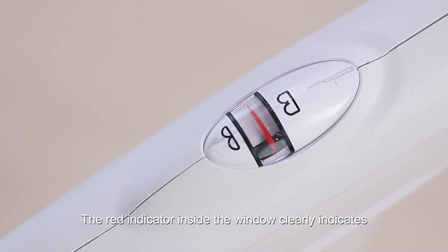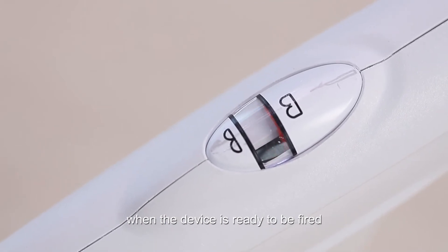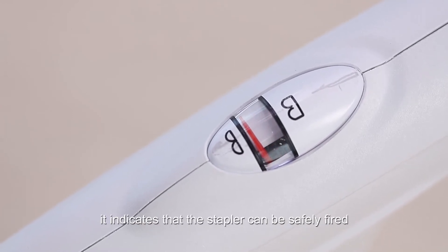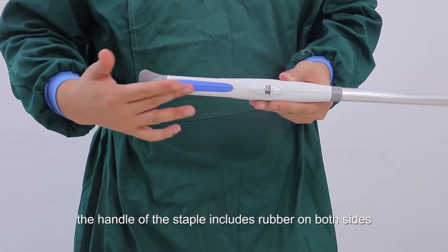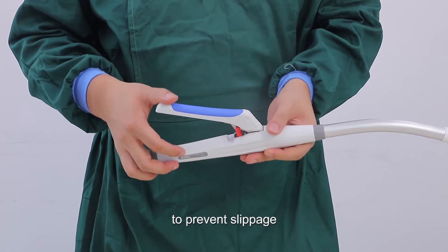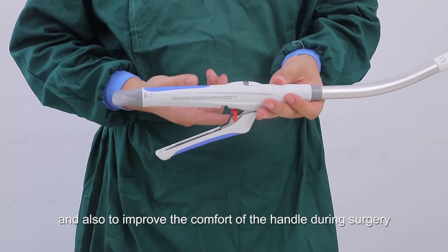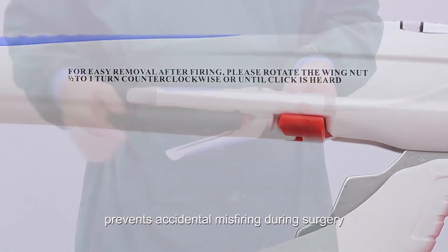The red indicator inside the window clearly indicates when the device is ready to be fired — when visible inside the window, the stapler can be safely fired. The handle includes rubber on both sides to prevent slippage and improve comfort during surgery. The red safety lock prevents accidental misfiring.